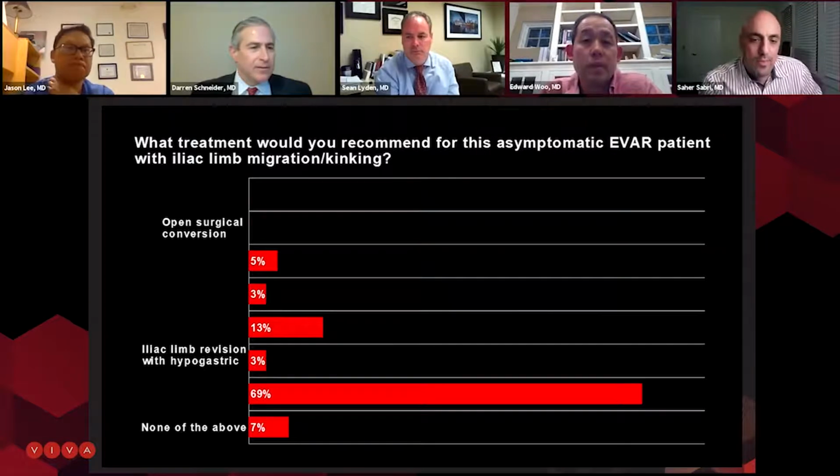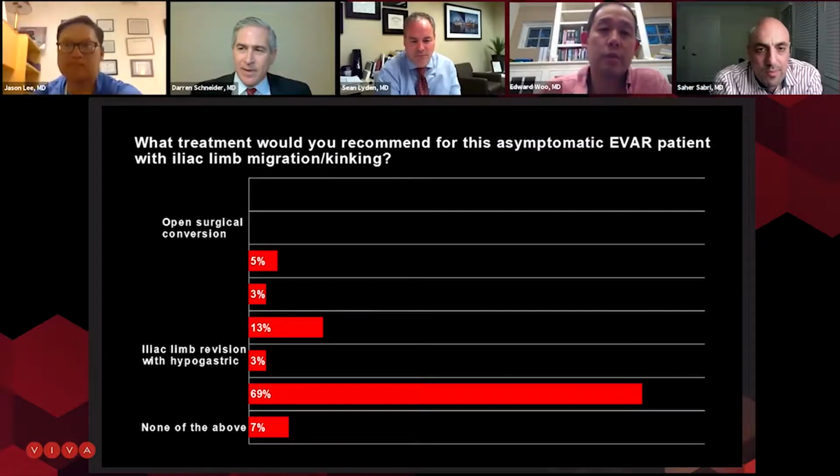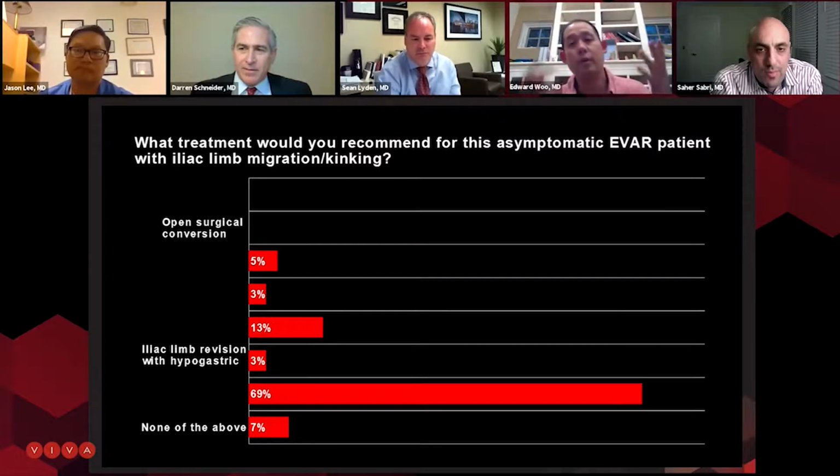Yep. And I think a good point here is, treating common iliac artery aneurysms, which is really what they were, and especially when they're short, it's not going to work. I mean, the durability of this device was what, a year and a half, 2 years. Ideally we're not looking for that. We're looking for more long-term treatment. And this is the type of patient that, done somewhere where there's no follow-up, the next time they follow up, it's going to be with a rupture.